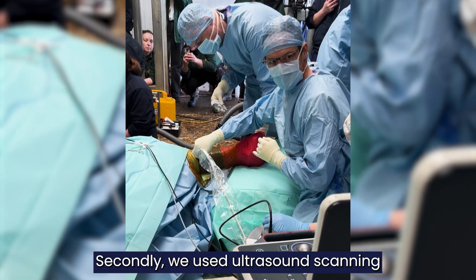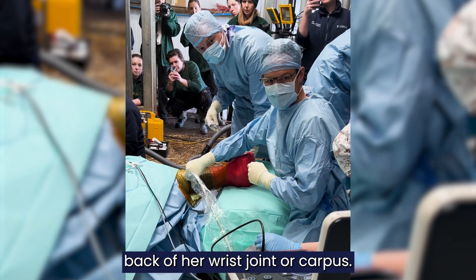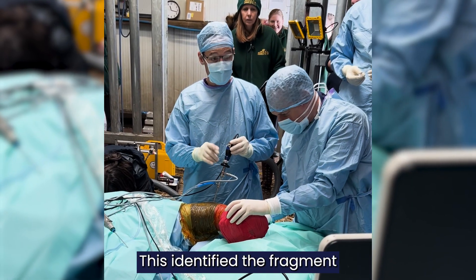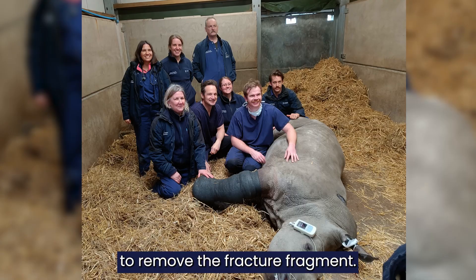Secondly, we used ultrasound scanning to identify the fragment on the back of her wrist joint or carpus. This identified the fragment and allowed us to make a very small incision to remove the fracture fragment.